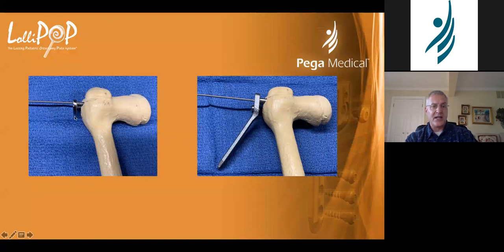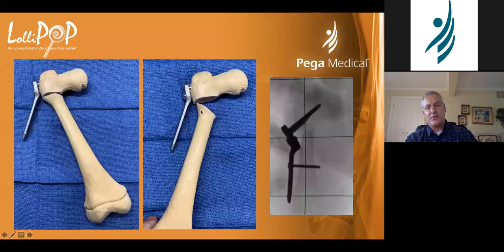And so this is my osteotomy. You can see that I did my osteotomy past my little connecting point of the chisel blade and the plate. And I did an opening wedge osteotomy. You can see, and even in surgery, you'll have these little bone fragments that you might have to deal with. My osteotomy, way too high. So you can see, and these are very tiny children, but that's the locking portion of this design. So my plate can be off the bone and act like an internal X-fix and lock this and still be extremely strong. And I'll show you the end result.